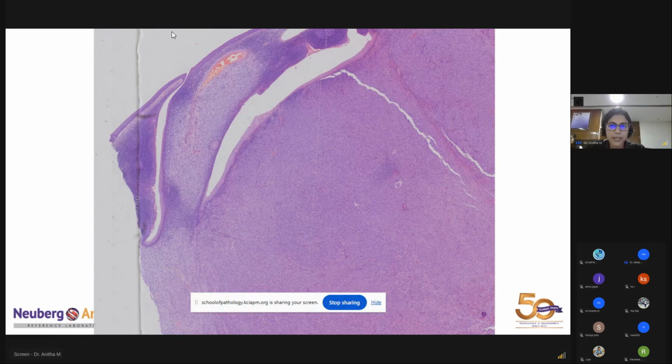Metastasis? More than metastasis, if you would get a biopsy from the tonsil query malignancy, before you put the slide on, what would you think, oh, this could be this? Maybe a carcinoma, squamous cell carcinoma? Yes, that would be the common thing that you would want to exclude first.